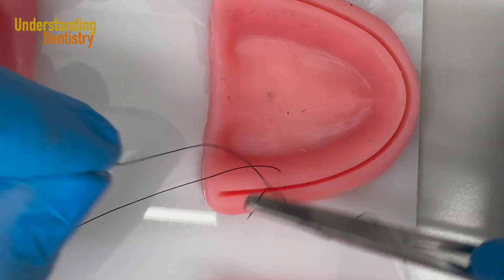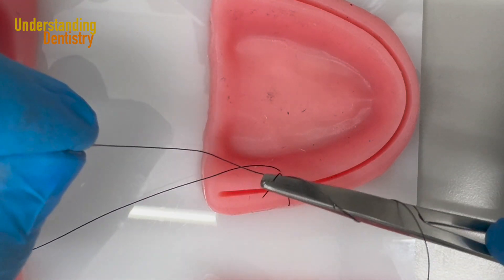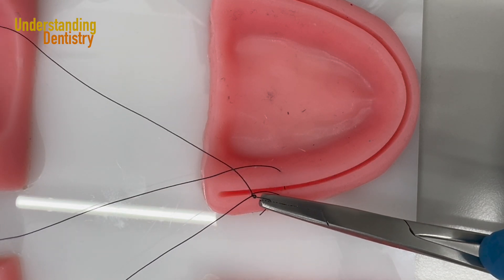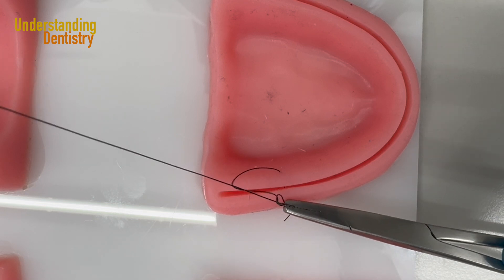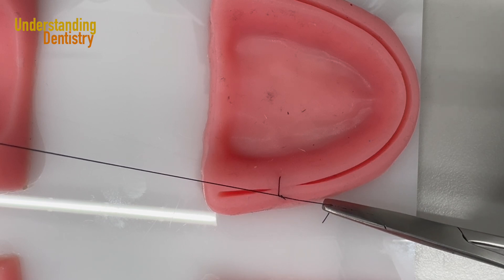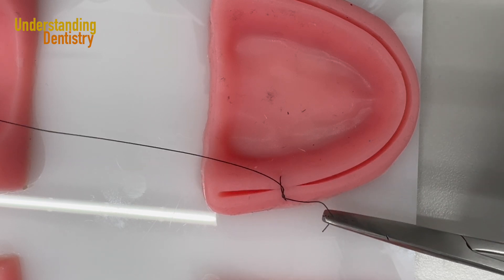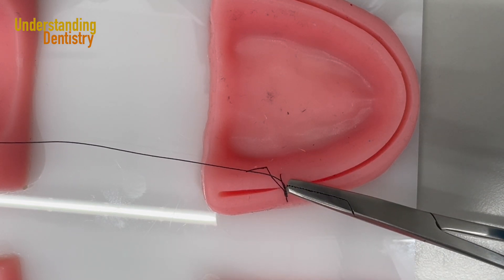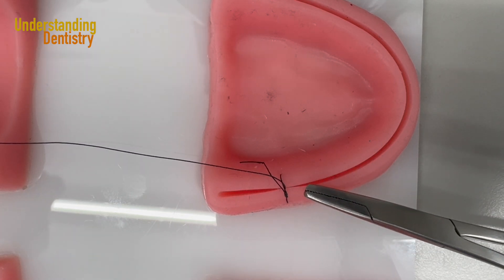Otherwise if I pull with both hands I don't have space — I will probably touch the tongue of the patient. I could touch the needle holder on the palate and that is not good. So I try to pull only with one hand — that's the best approach. Only at the end can I try to pull with both hands. Take a look: my knot is on the buccal mucosa, not on top of the incision. You don't want your knot close to the incision — you want it buccal, and never lingual, because it's less comfortable for the patient.